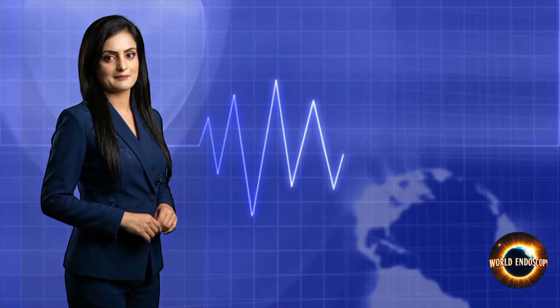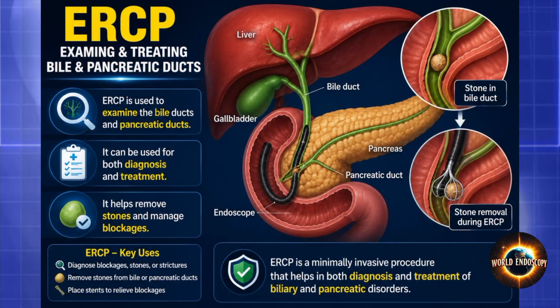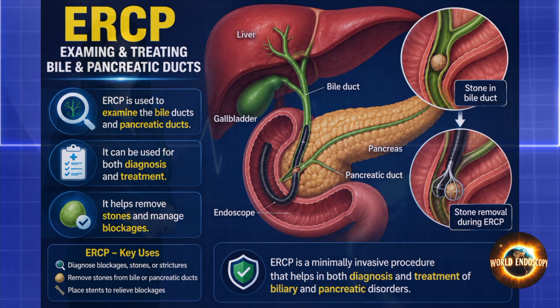ERCP is used to examine the bile ducts and pancreatic ducts. It can be used for both diagnosis and treatment. It helps remove stones and manage blockages.